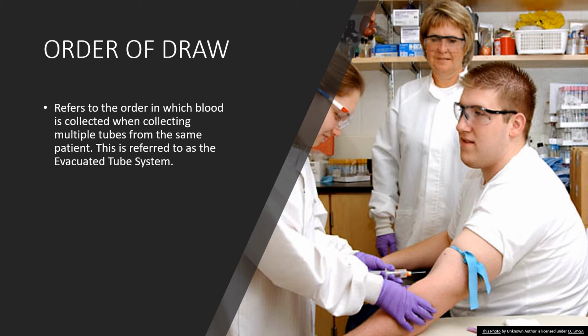But you put your tube on there, draw the blood in, then you can remove that tube while being able to leave that one needle still in that patient's arm, pick up another tube, place it on there, and you can go forth. You can draw 2, 3, 4, 5 tubes while only having to stick that patient one time. So this is a very safe and effective system to draw multiple tubes, but we have to make sure that as we're using this system, we are drawing these tubes in the correct order.